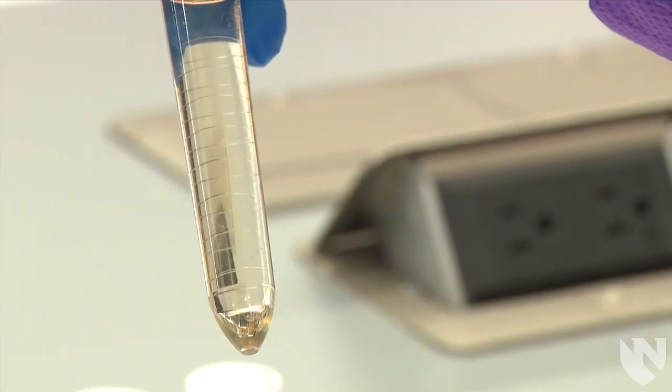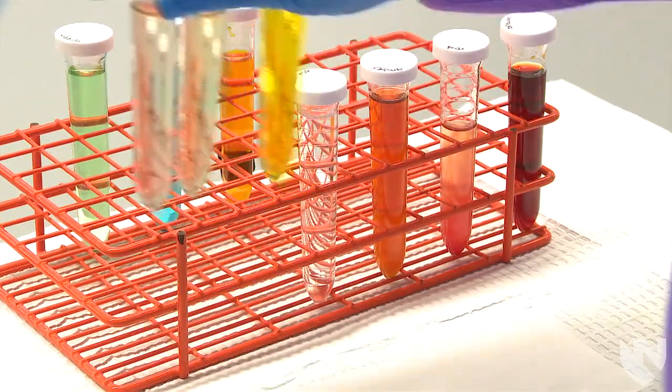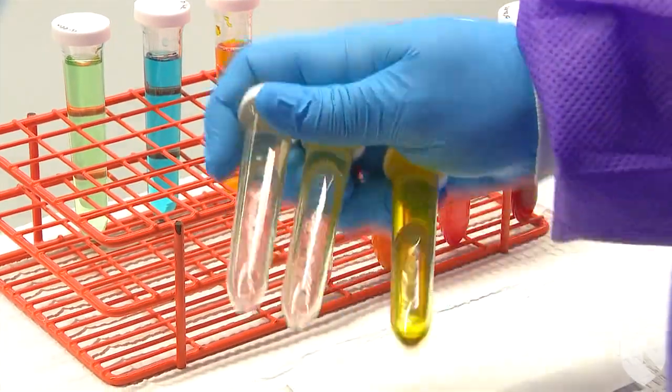The specimen for this test is fresh, uncentrifuged urine in a conical test tube. We will begin by inverting the urine several times to mix it.